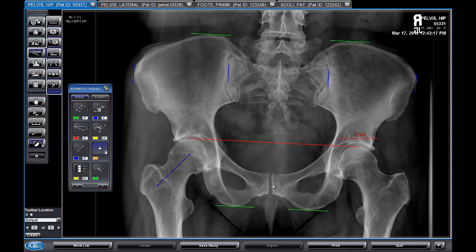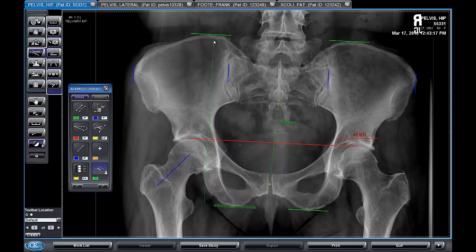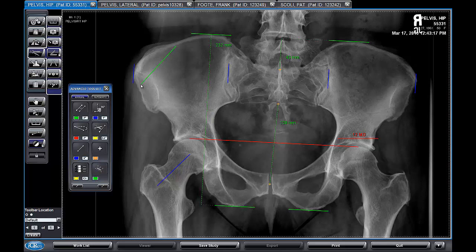The point tool allows you to drop points with a single click. The measure distance tool allows you to compute the distance between any two points, a line and a point, or two lines if they're parallel. So we can determine the distance between two points, between two parallel lines, or a point and a line — which generates the perpendicular distance to that line. We can also generate distances to segments, such as the distance between a point and one of the segments of an angle.